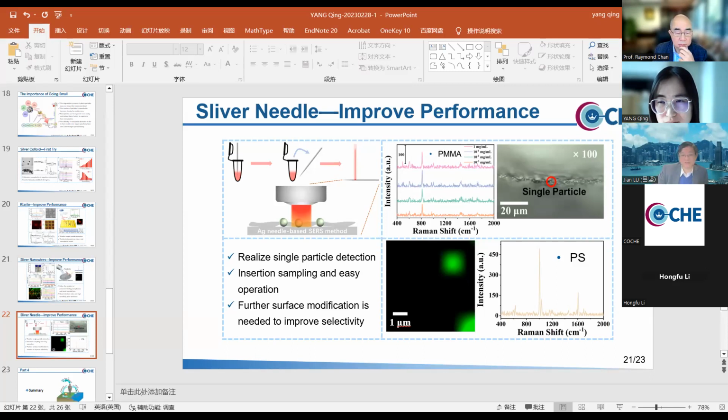I don't know if I say that clearly. So, for example, for COVID-19, we have used another material to attract the COVID-19 virus on our needle, and we can see the virus. Here we try to do a similar strategy, but first we need to see if we can see a small particle using this needle type sensor. And this was what Jian has done to demonstrate this.